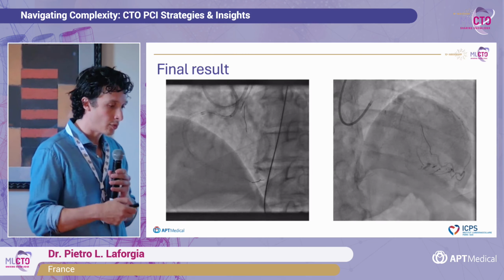Guide catheter support is mandatory, of course. And how can you increase the support? Of course, you can increase it with a guide extension. The Expressman, I think you're all familiar with, has very nice characteristics of deliverability. It advances very nicely. It's very, very well hydrophilic. Really, I never have any problem with advancing it in the vessel.